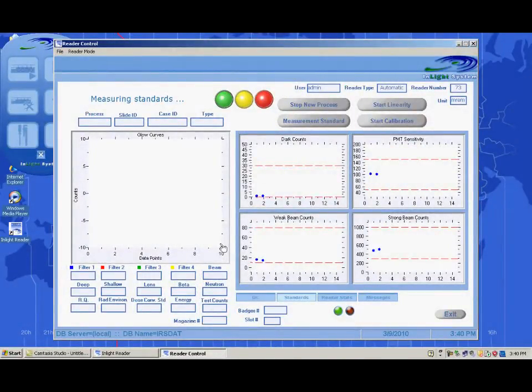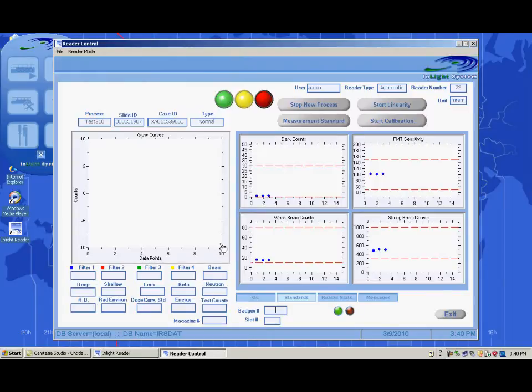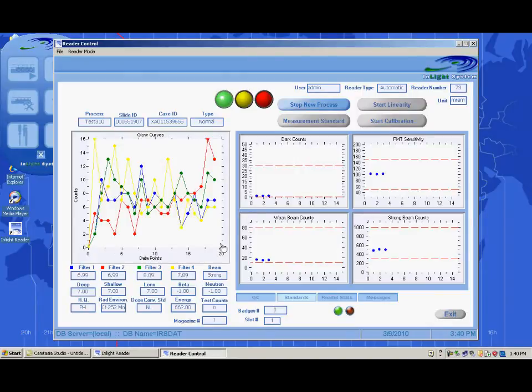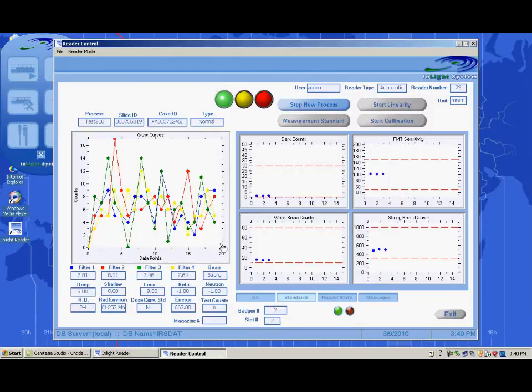When the test has successfully completed, the reader will load the magazine from the magazine changer into the analytical section of the reader. One dosimeter at a time is loaded into the reader for analysis. Data points of PMT counts are taken and entered on the reading graph to display a glow curve. When all of the dosimeters have been read, the magazine is ejected from the analytical side of the reader and placed again into the magazine changer.